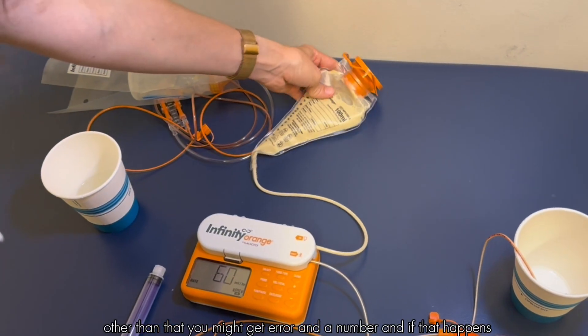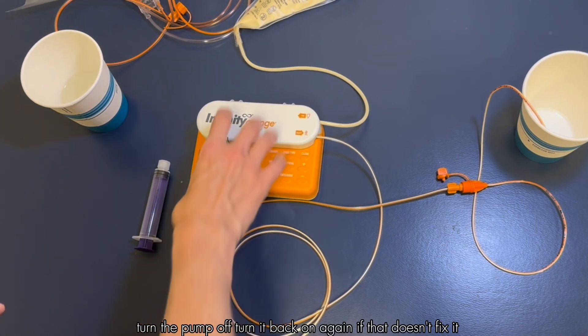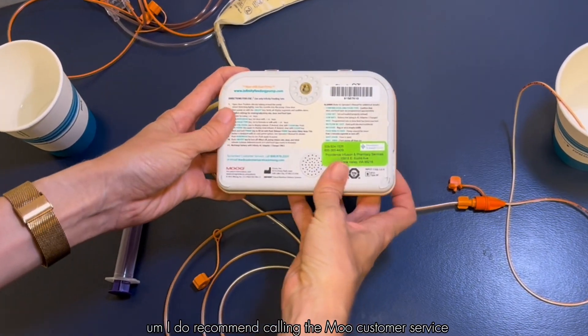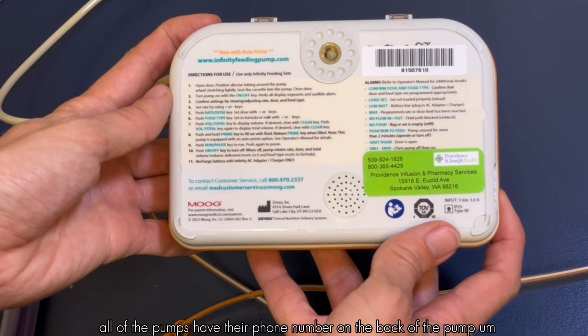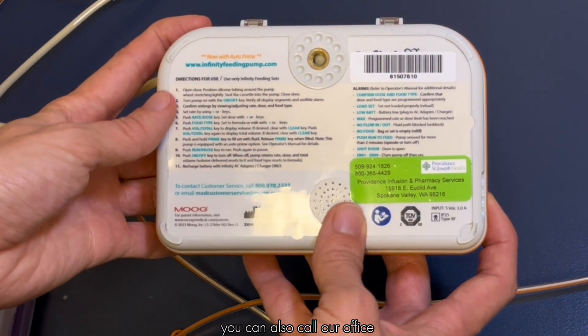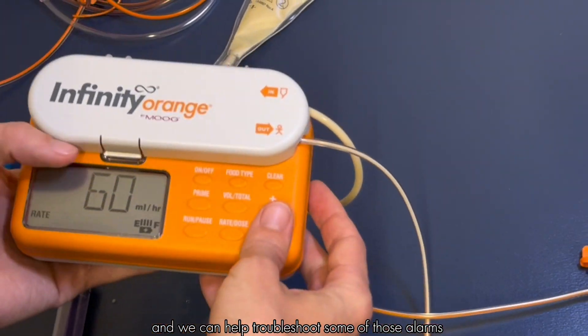Other than that you might get error on a number and if that happens turn the pump off, turn it back on again. If that doesn't fix it I do recommend calling the Moog customer service. All of the pumps have their phone number on the back of the pump. You can also call our office, we're open Monday through Friday from 8 to 5 and we can help troubleshoot some of those alarms.